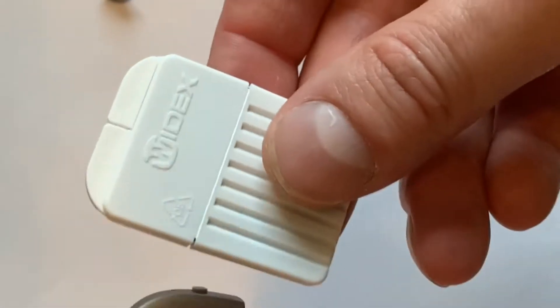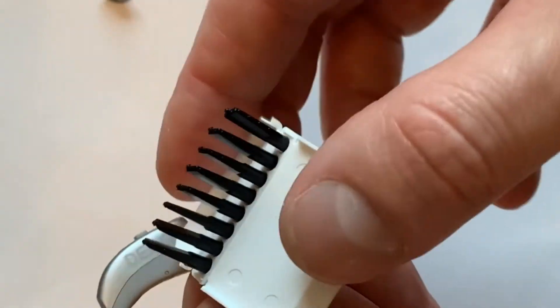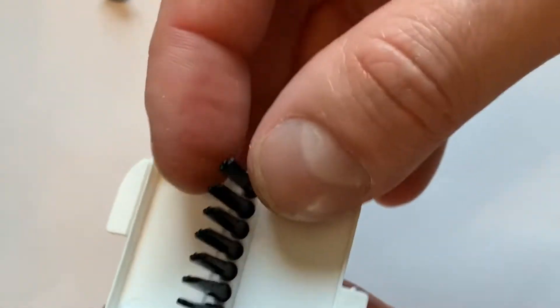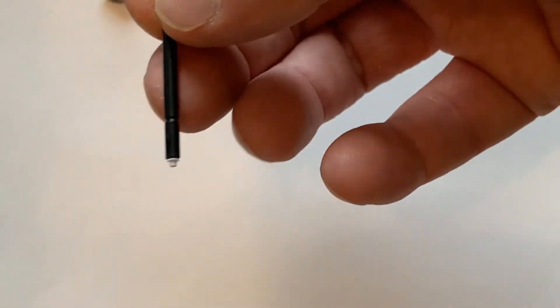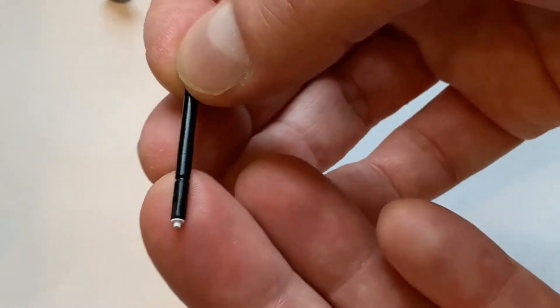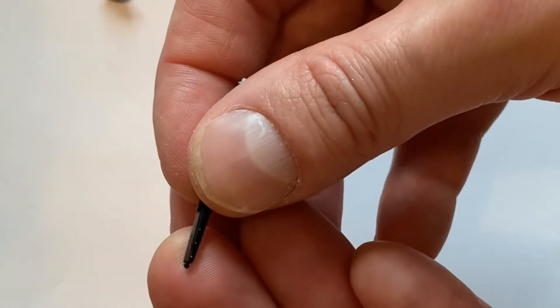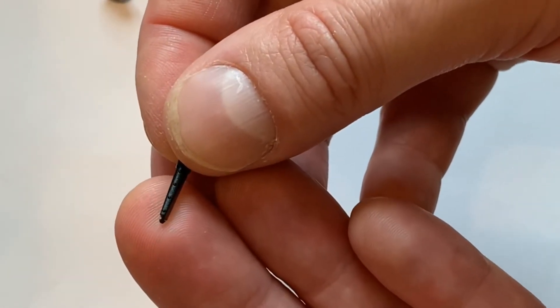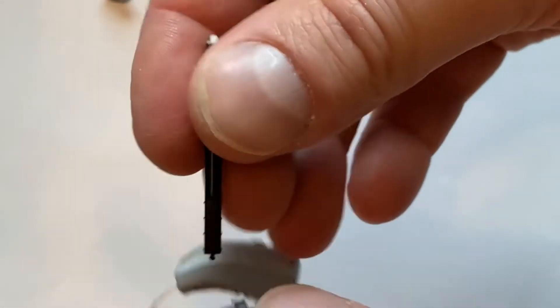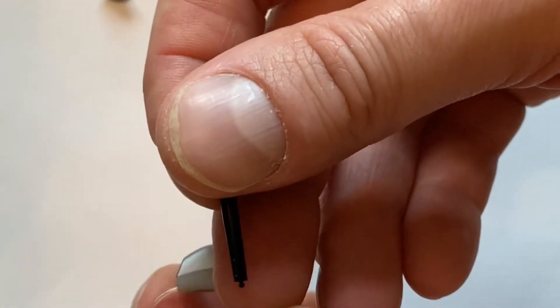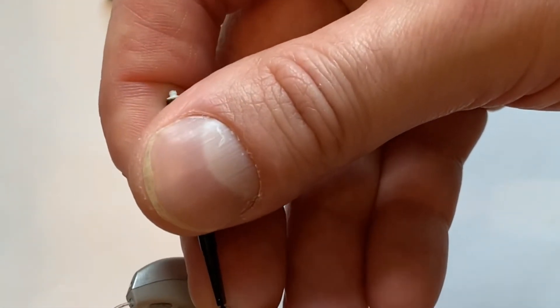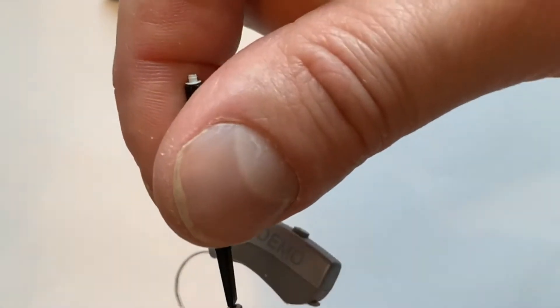So what we're going to do is we're going to grab our package of replacement wax guards and inside we have eight black sticks. We're going to take one of those sticks out and what we have sitting on the end is a white filter. And on the other end, we have a little hook that has two barbs on it and that's what we use to remove it. So we want to stick that barb straight into the end, into the center of it.